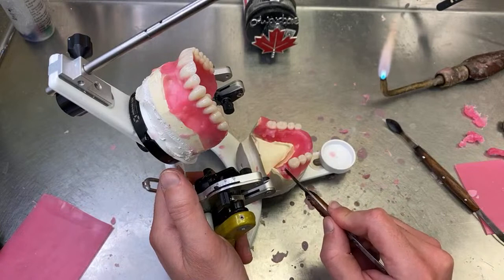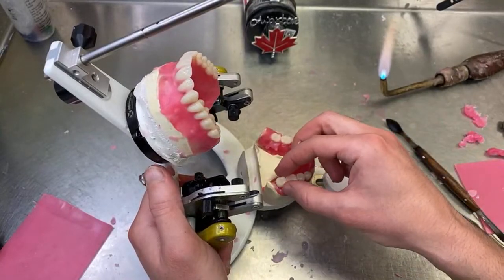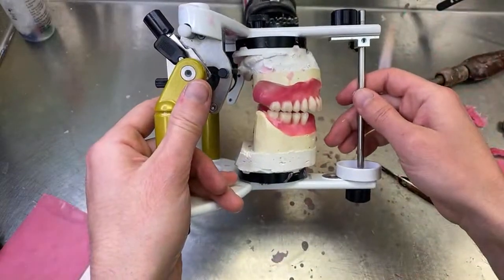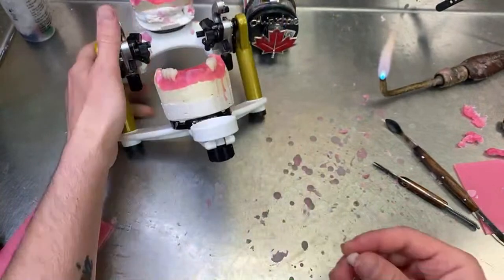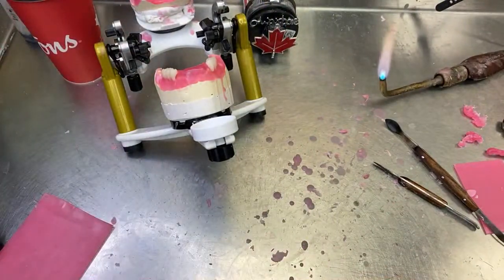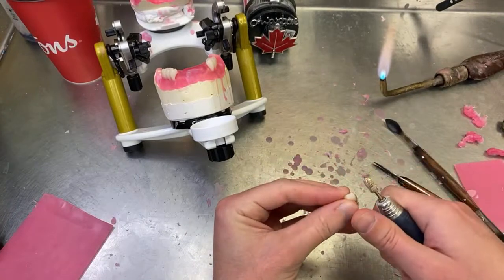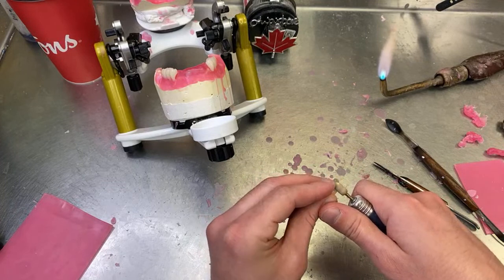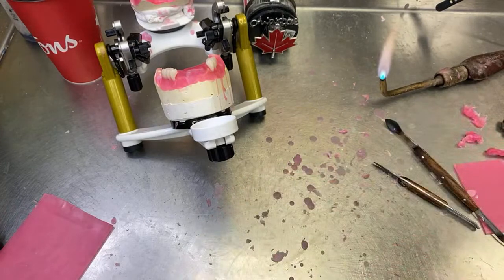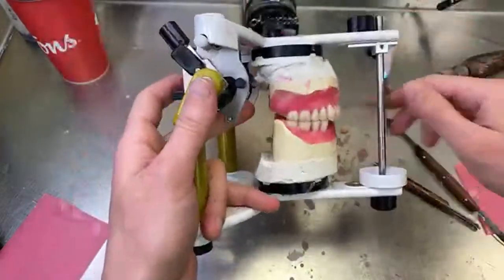Always make sure you heat up the wax right next to the tooth that you set before, so it does not move when you're pressing or anything. If anything is going to give in, it would be just the wax. Oh, I think we're gonna need a trim here. Yep. So that tooth here, see, it's hitting in that area here. So what I'm gonna do, just a quick trim. So it's probably hitting in that area here. Always something.